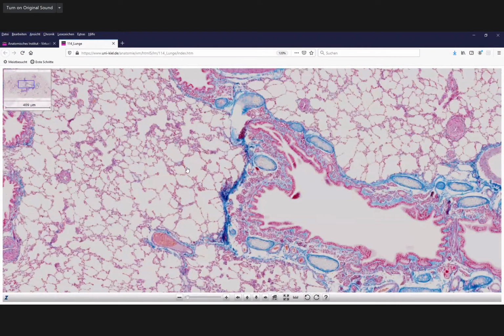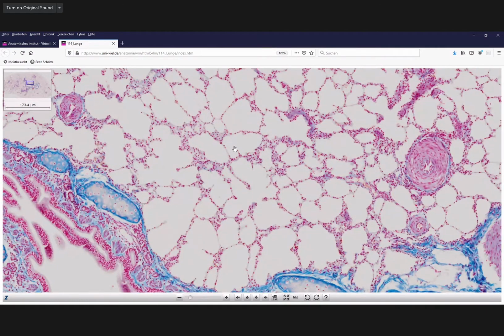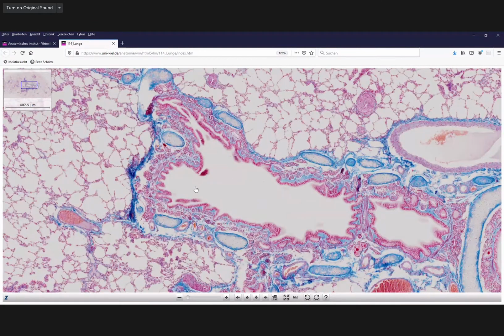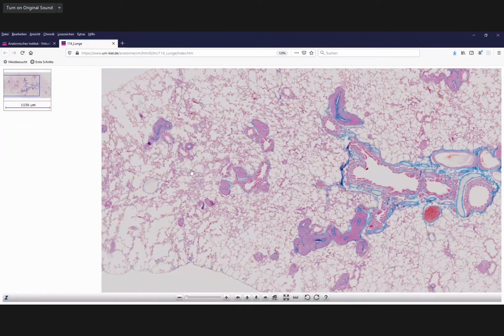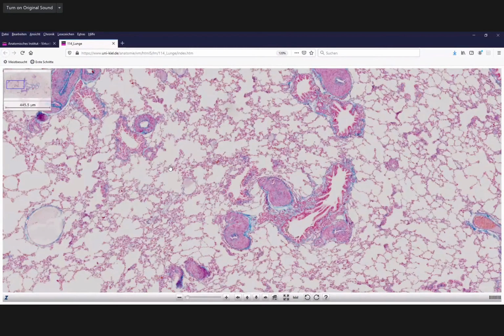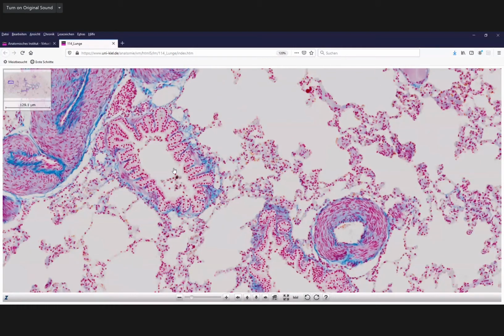And then you can see now here everywhere the bronchioles. All these empty spaces now are alveoli. And you can imagine that our bronchi branch and become smaller and smaller, and then the branches turn into bronchioles, and the bronchioles branch and become smaller and smaller. Here you can see there's even a smaller one. And you can see now a very nice cuboidal simple epithelium lining everything here.